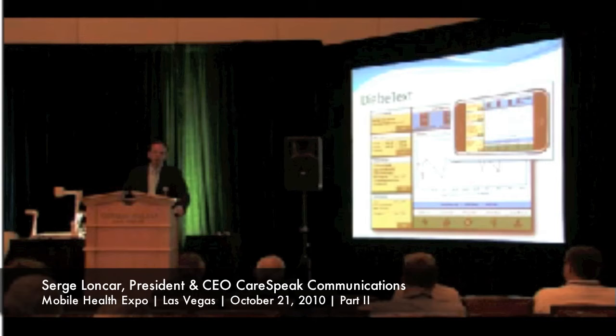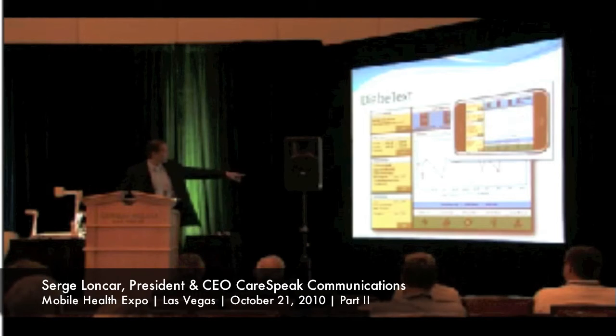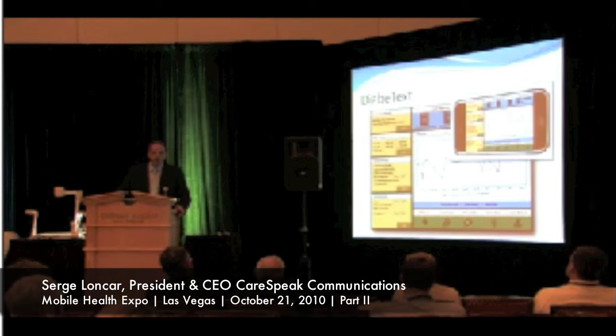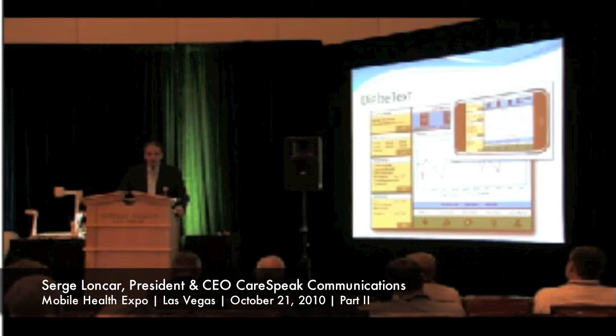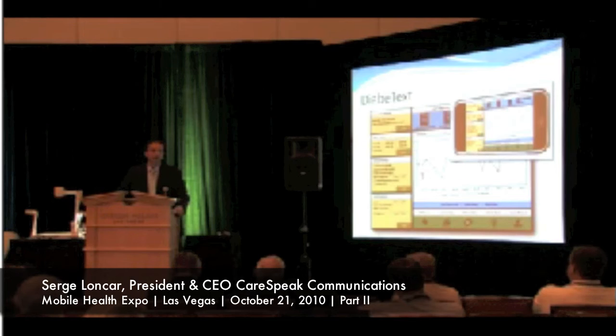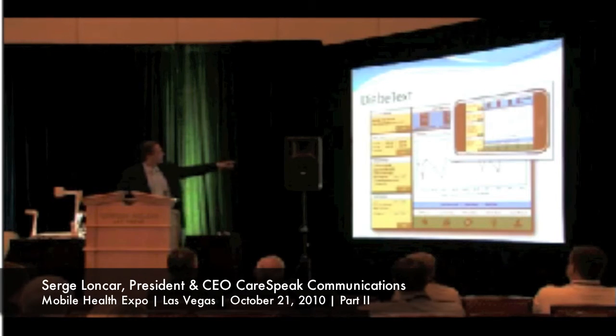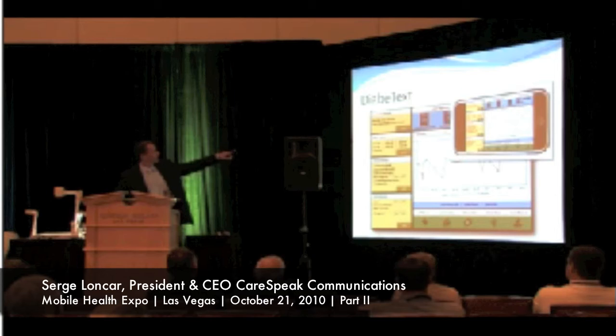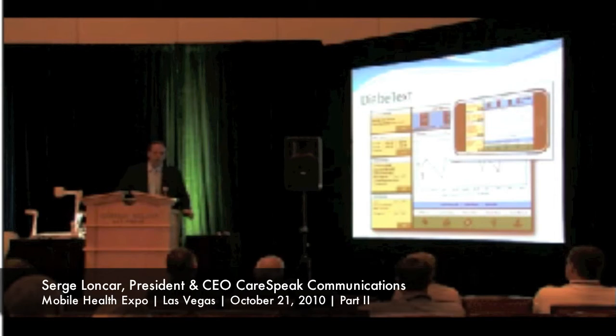Secondly, it gets automatically forwarded to up to 2 caregivers, which is here on the bottom. Are the caregiver numbers, so there's only one set up for this account. So there's really peace of mind for the parent, and it can also be forwarded to the nurse. And then if the child doesn't respond within a certain amount of time, again, escalation alerts go up. And if the reported values are out of range, if you look at the third box in yellow, value settings, there's a low of 85 and a high of 180. So when this person reported 200, an escalation alert would have gone to both the parents and back to the patient saying, your glucose is out of range, please contact your caregiver.